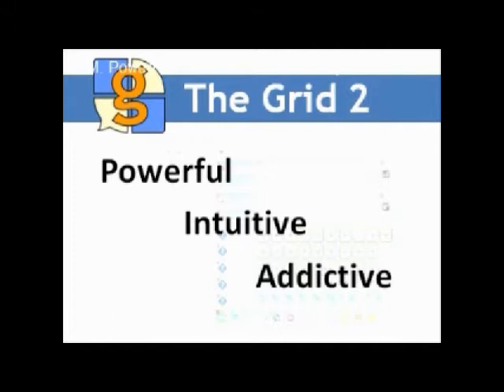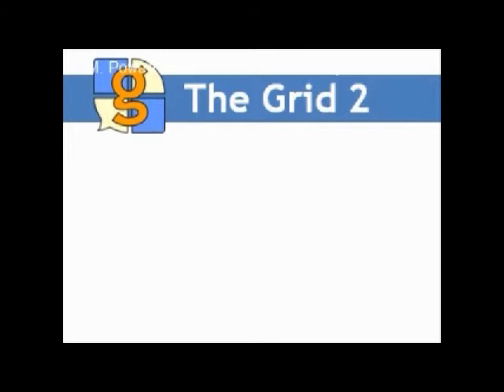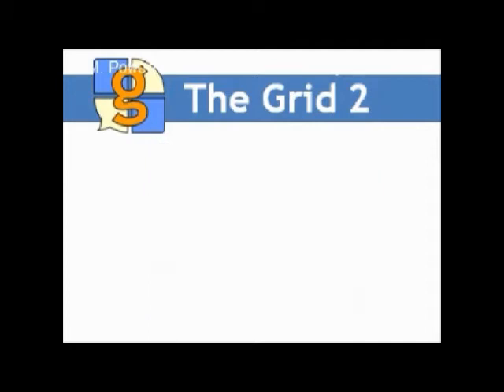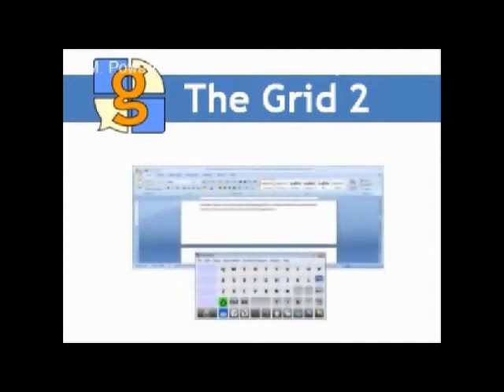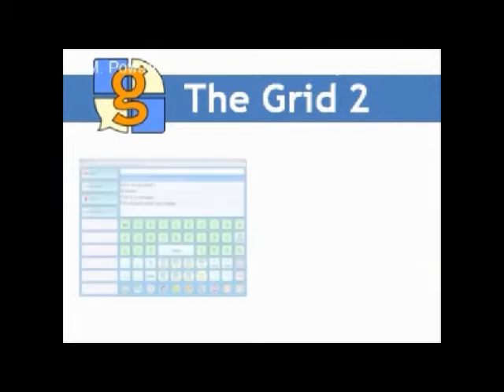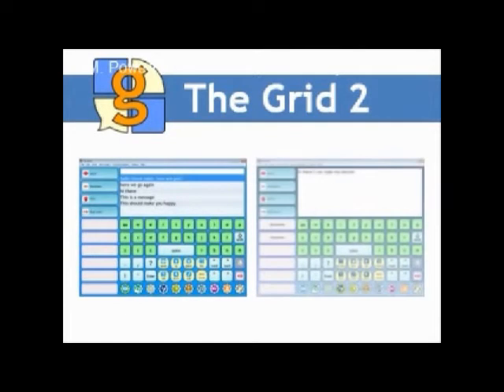I had spent some time using the standard grid layouts. I consider the grids to be of two types: dedicated grids with no Windows elements showing, and grid overlays which coexist on the screen with Windows applications. I had initially expected to have limited control with Windows applications and so concentrated on the dedicated grids. The first grids I modified were the communication grid and word processor.